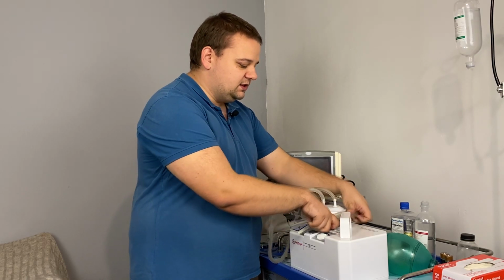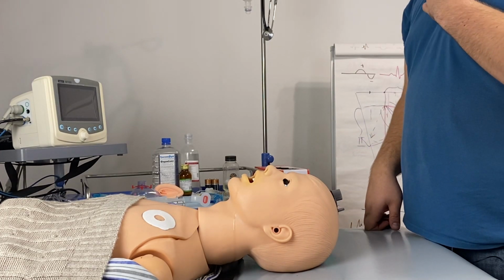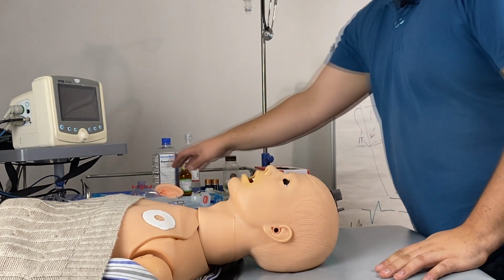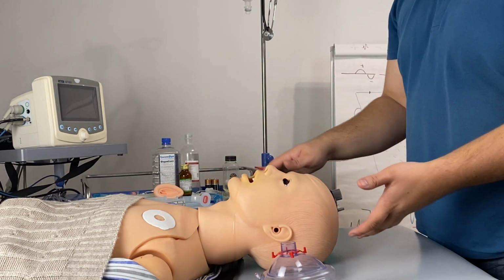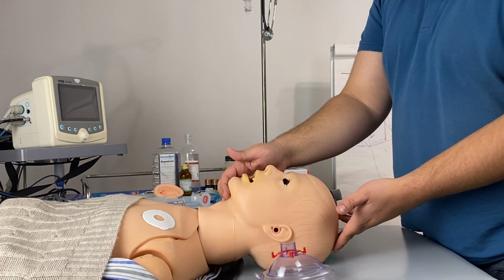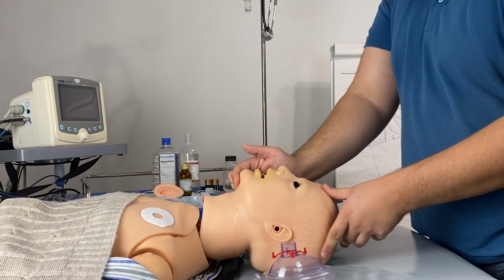And now, when we are familiar with all the devices, we should look at how we install them. So now let's try to use all these airway management devices. First of all, the face mask. To use it, we will have to open the airway of the patient every time, just as we do in basic life support. We will do it like that.